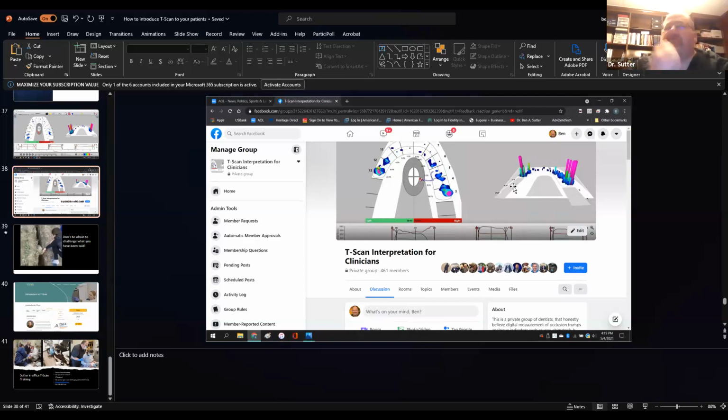One of my biggest frustrations with it was that the ink didn't mark off of the sensor like it does off the AccuFilm. That's number one. And number two, the Wi-Fi is only connected to your iPad for a very short period of time. Then you have to stop what you're doing, take your gloves off, reestablish the Wi-Fi or Bluetooth connection, and then go back to the patient.